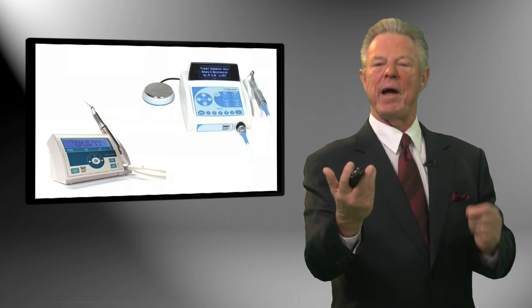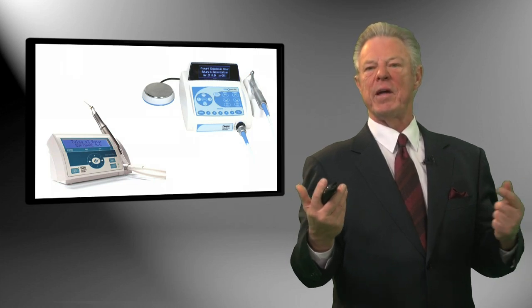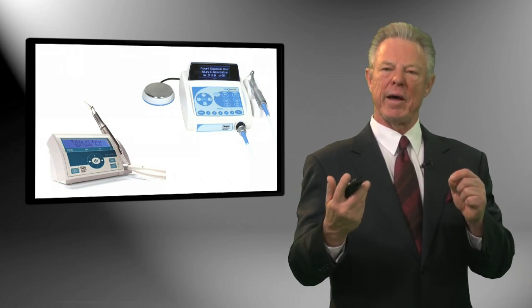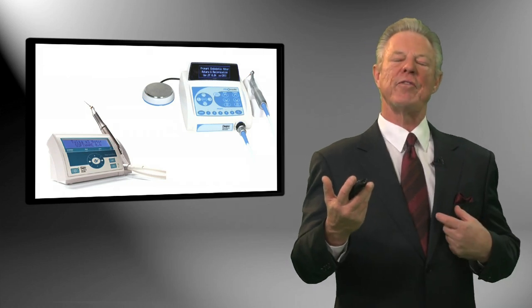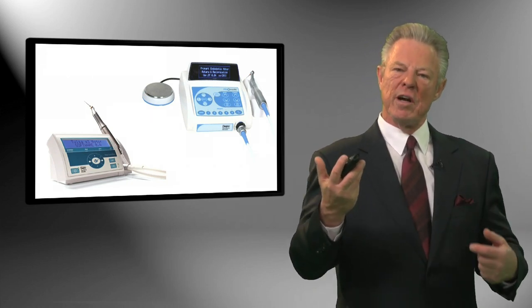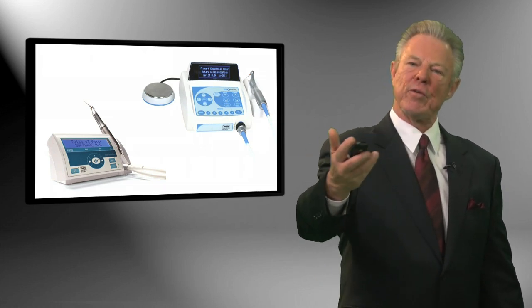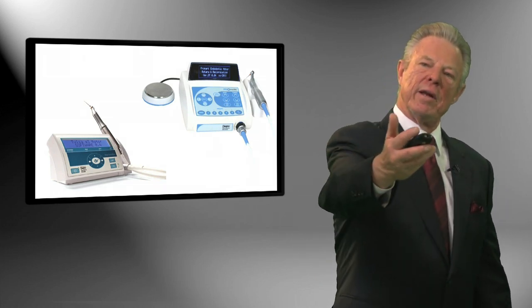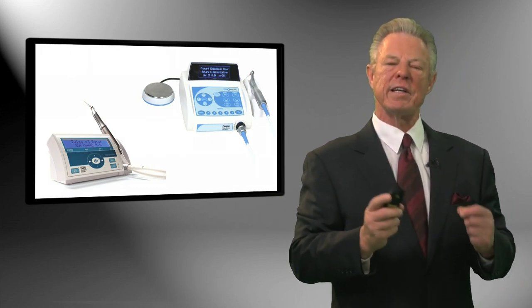If we have a glide path, then the work or skill is done, because the design of the metals has allowed us to follow and shape. So really our job is done. We can almost go along for the ride. I would encourage you to say these words: just let it run and paint. If you want to say brush, that's fine. Let it run and brush or paint. That way you're not trying to get to a rubber stop.